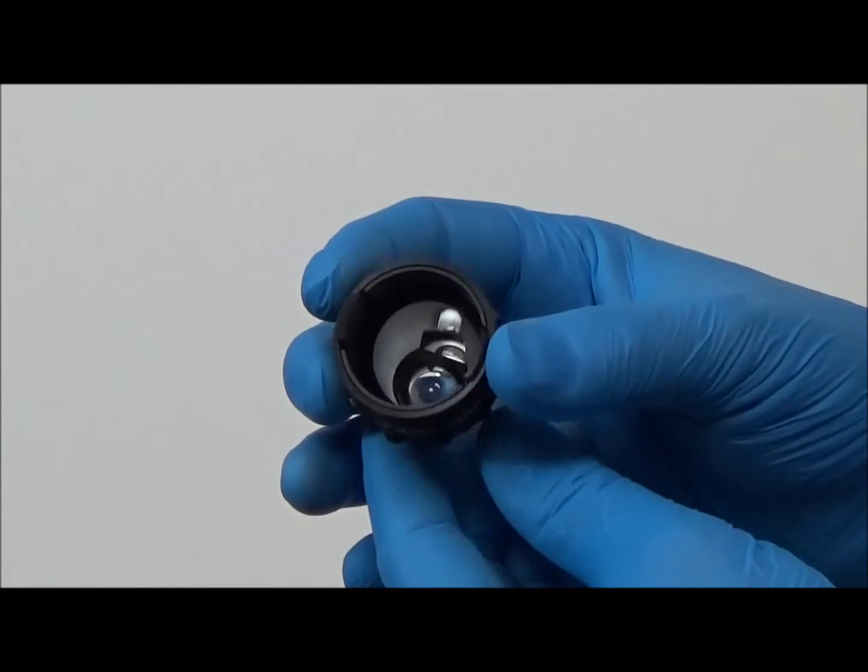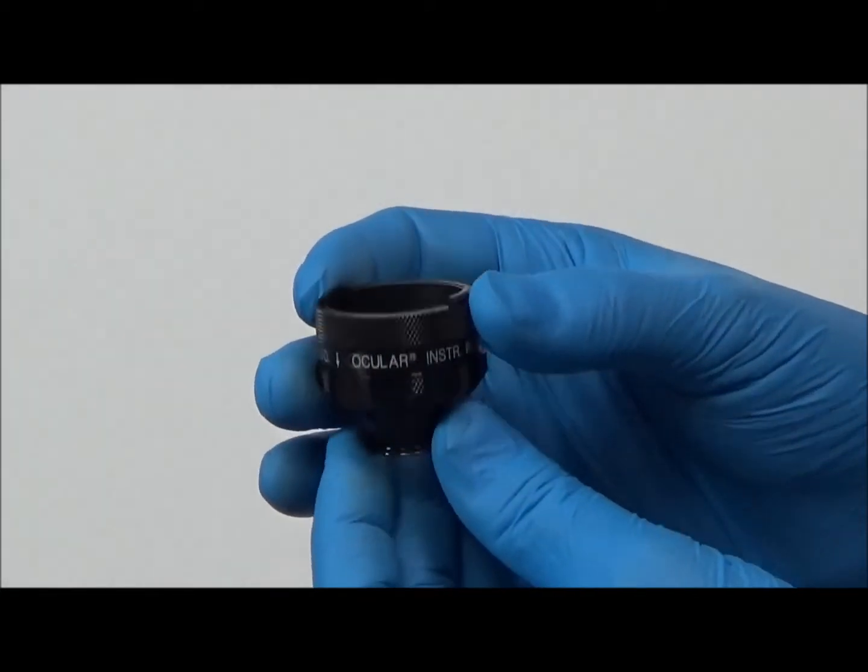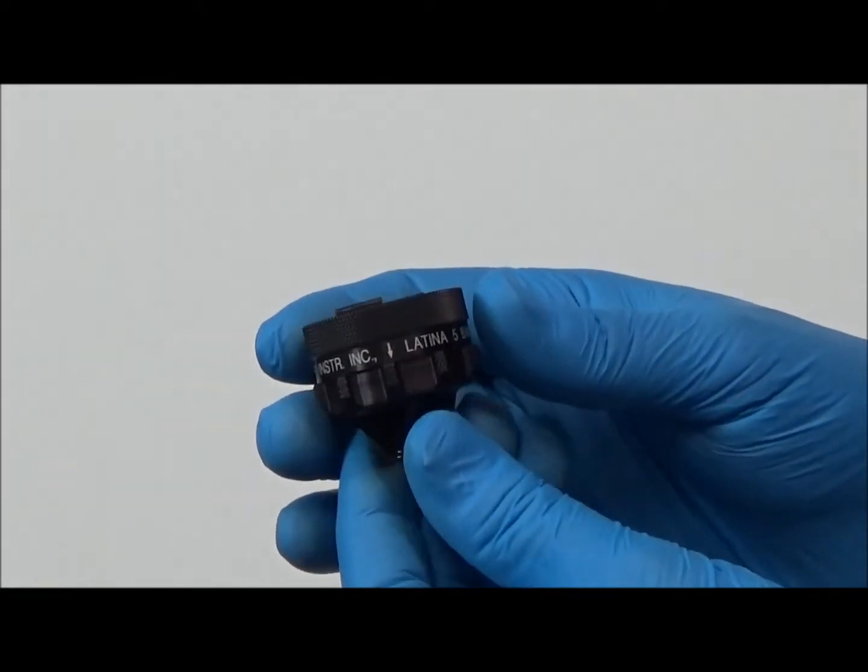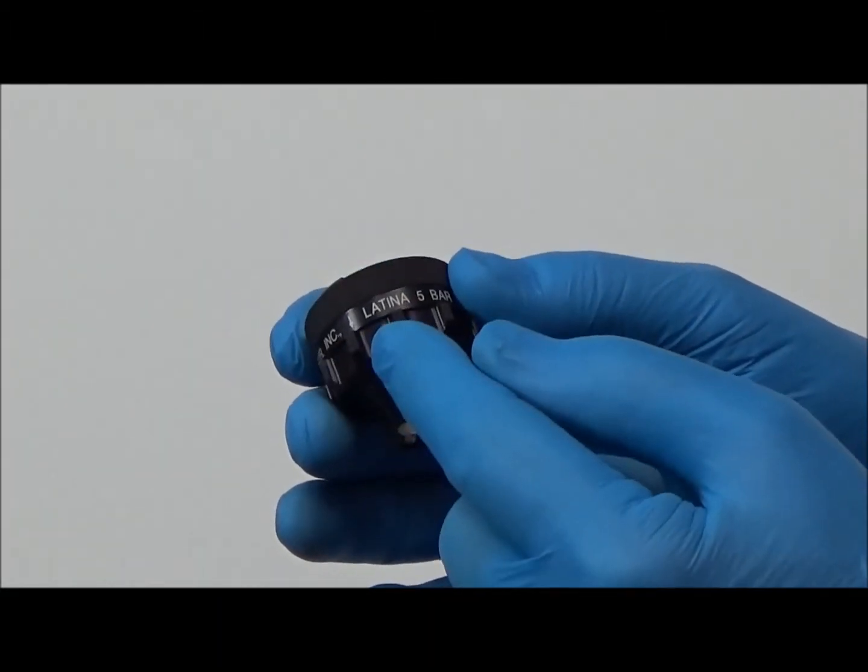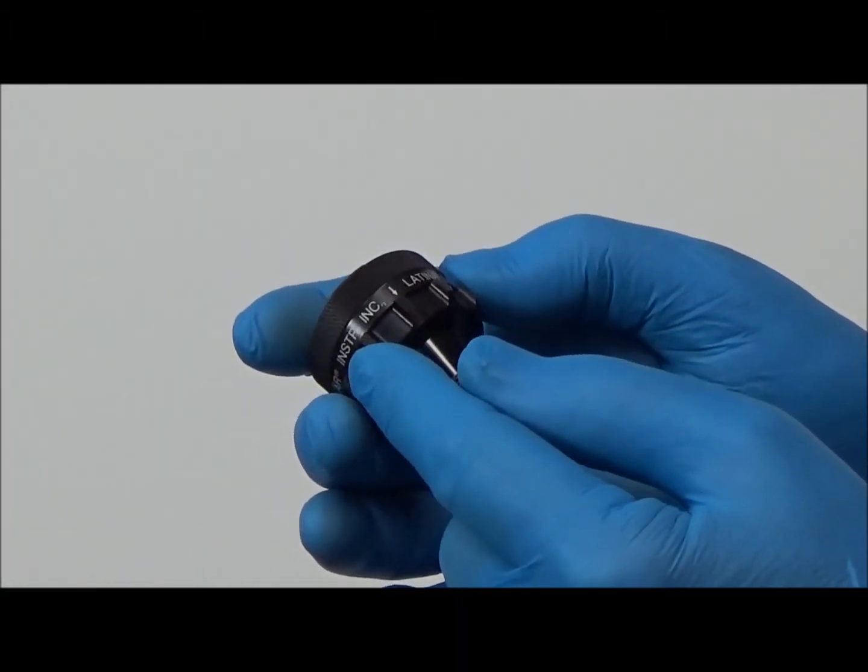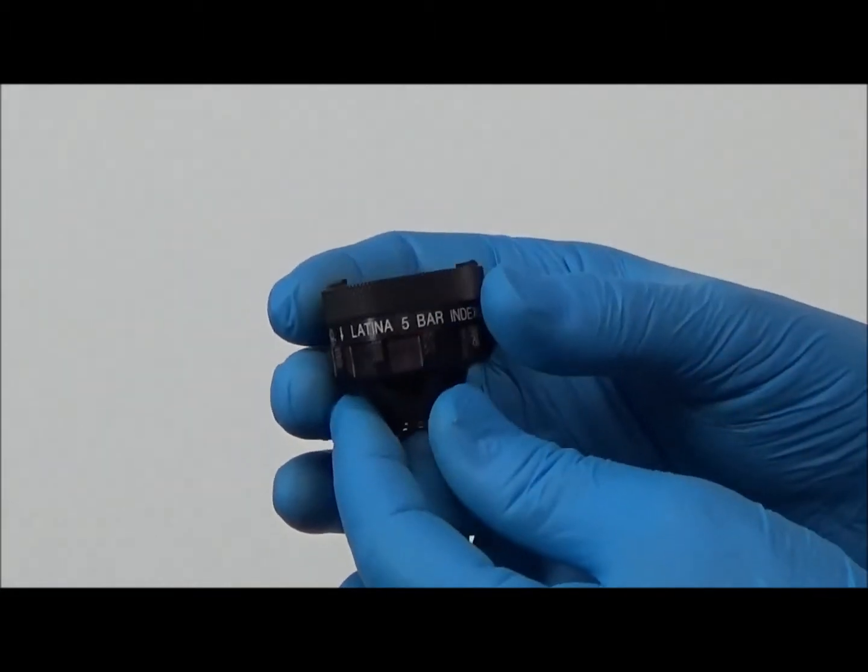The Latina indexing 5-bar lens consists of two main parts: the anterior knurled rim and the lens with its extended knurled tabs. Note the anterior rim is easily removed for cleaning.